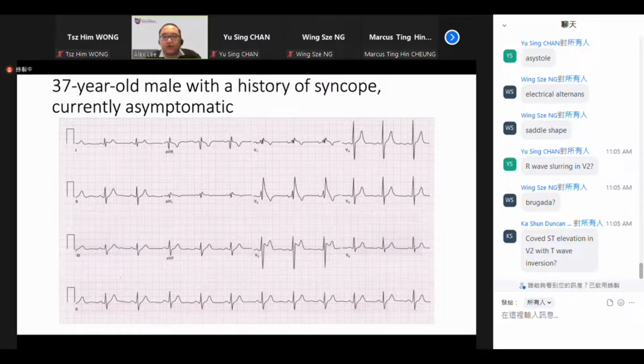what is the usual sloping direction of the ST segment? Is it usually upsloping or downsloping, or flat, or convex or concave? How do you describe a typical ST elevation in the STEMI patient? The ST segment is usually downsloping or upsloping.